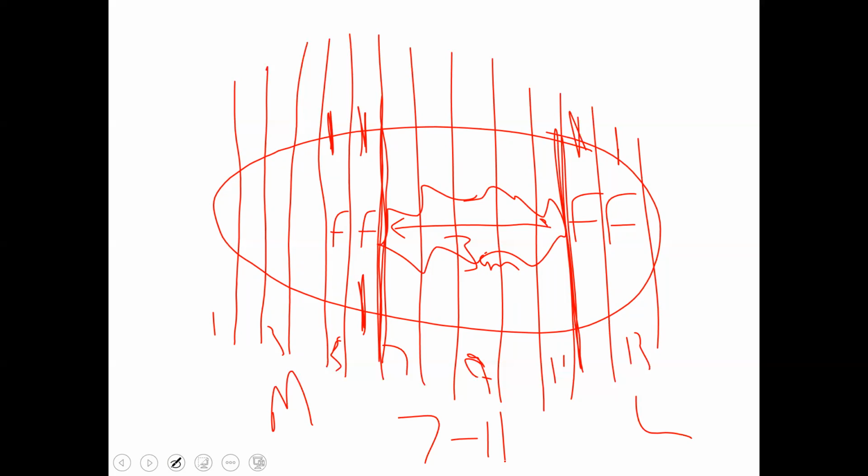As you review the gross of the breast, you'll see that we ask for these flank sections. If you're thinking through what's going on and understanding what you're trying to generate, then it becomes a lot easier. So what's the simple summary here? We need to know how big the invasive carcinoma is.